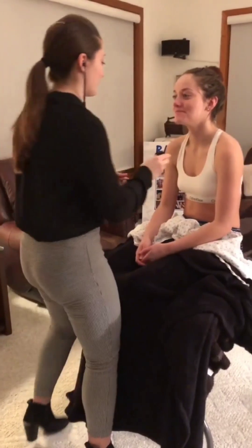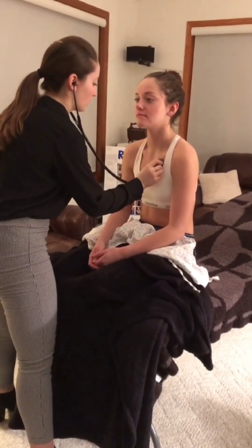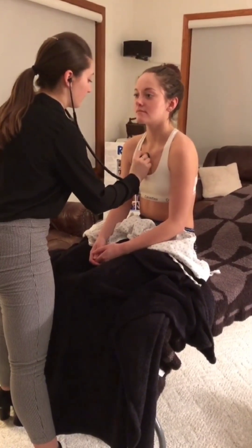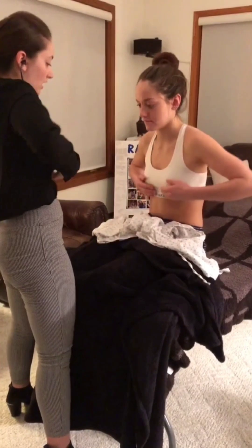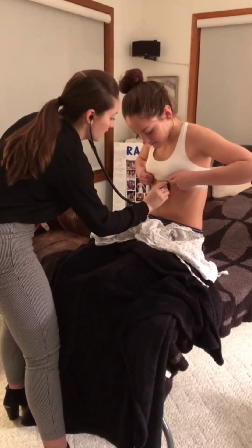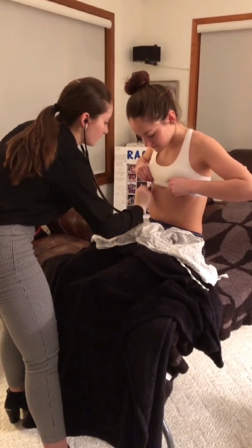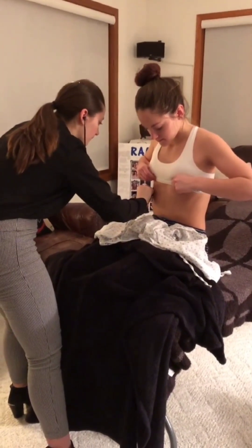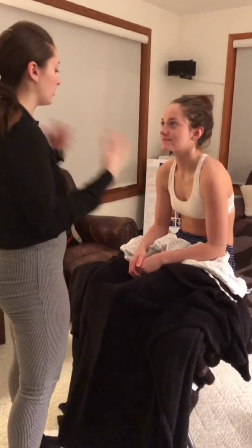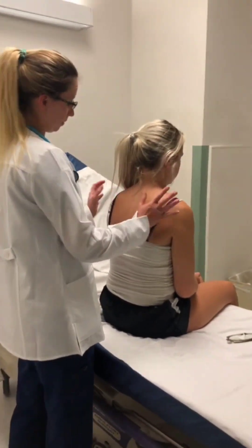Next I'm going to have you drape your chest — I'm going to listen in the front. You can put your shoulders back. Same thing: each time I place my stethoscope, I'm just going to have you take a deep breath. Next I'm going to have you roll up your sports bra and just hold it like that. Two more. Awesome, everything sounds great. You can go ahead and slip your gown back on. Now I'm going to do your posterior back chest — we're going to inspect.